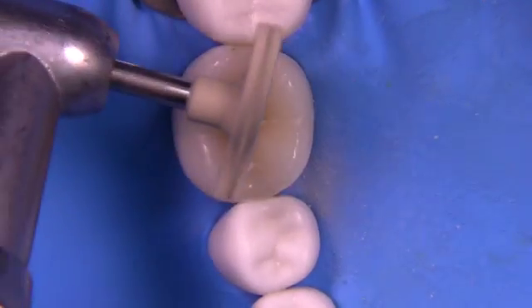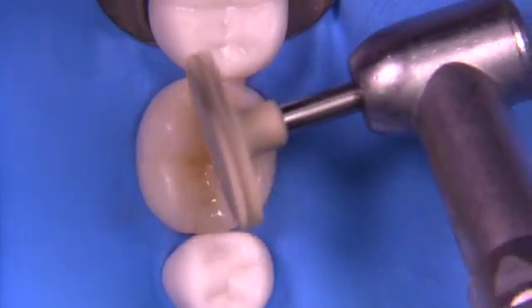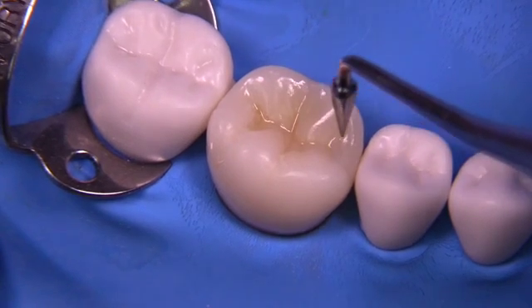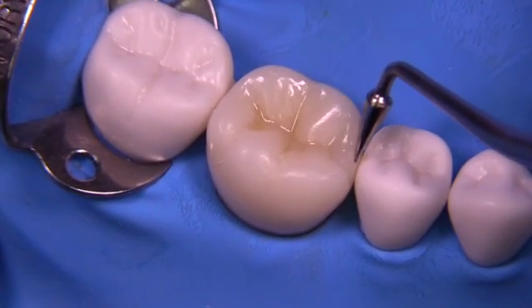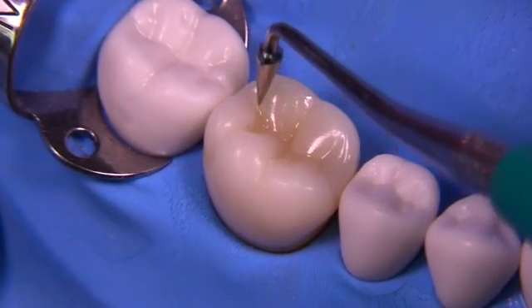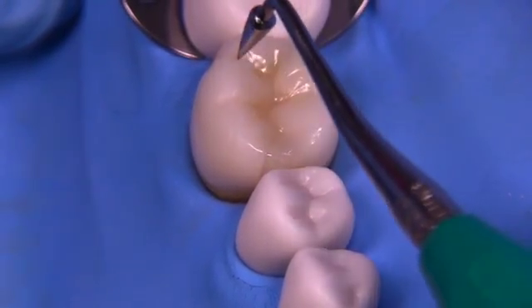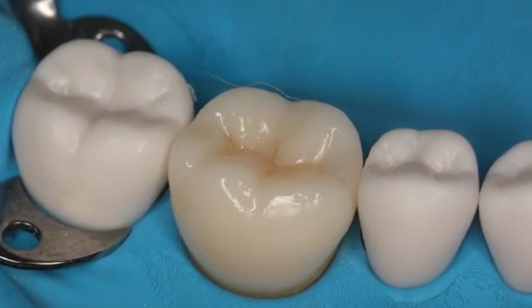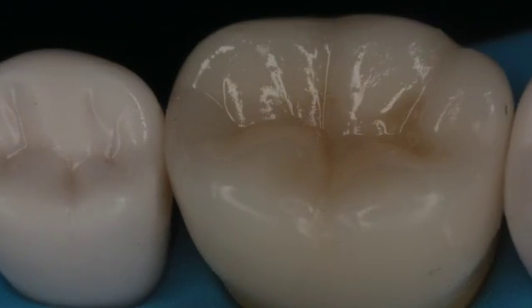Because you have nice deep grooves on the occlusal, you'll get some powder accumulate — just rinse that out and it usually reveals a really nice surface underneath. I find this to be quite typical with the Diacomp system. I'm showing how we were able to replicate the anatomy reasonably well by utilizing the anatomy that was already existing. One of the things I love is the creation of an occlusal embrasure to go with the buccal, lingual, and gingival embrasures. Make sure you don't have any flash — you can always use blades interproximally and things like that. The results are here; I think they turned out okay. I wish you all the very best on whatever examination you're taking. It's been a pleasure — take care.